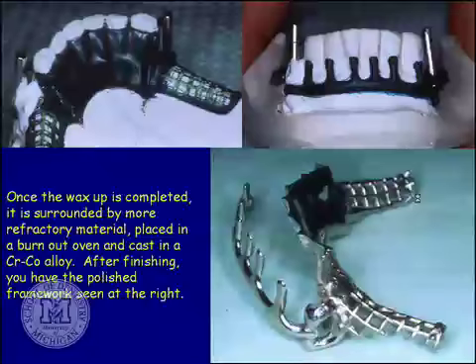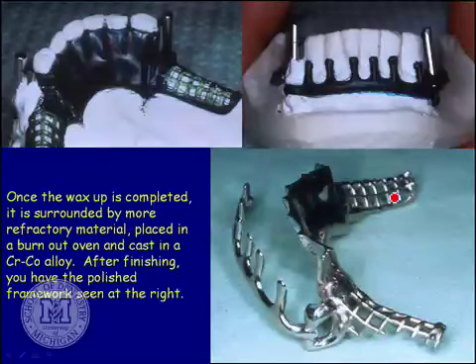So here's another view of the things. Here's your lingual plate, here's your meshwork, labial view, here's your two spindles. One side is going to be the gate side, that's going to be a hinge. And the only difference on these things is which one's the gate and which one's the hinge at the wax-up stage. If you look at the cast metal right here, this vertical part right here is the bottom part of this spindle right here. The top part of where the spindle was has been cut off and polished. And so where this has been cut off and polished is what stands up in the air.